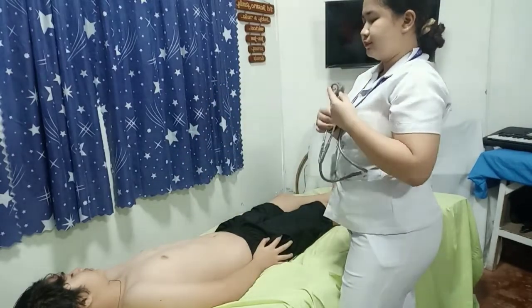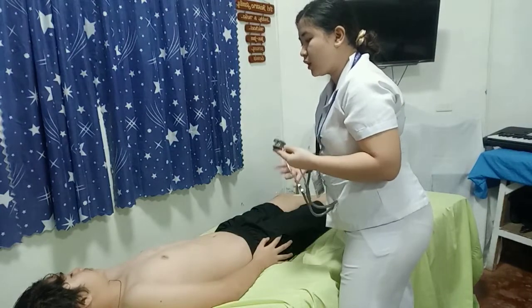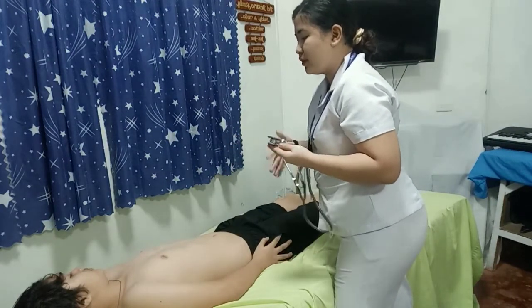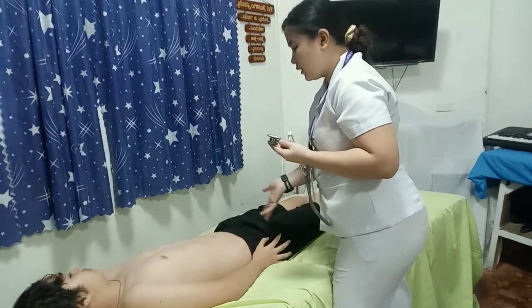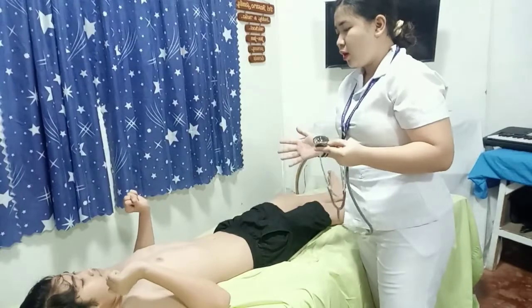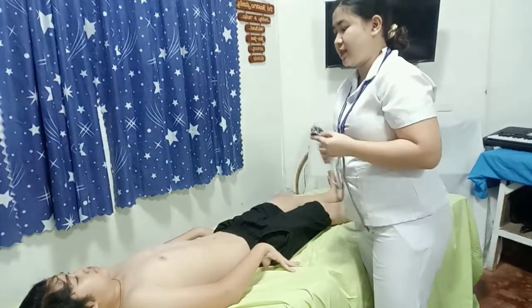Okay, so I can hear some coarse crackles here at the left lower lobe of your lungs during inspiration or when you breathe in. So, okay, you can now sit down, Kevin. I am just going to take note of all the findings in this assessment, okay?